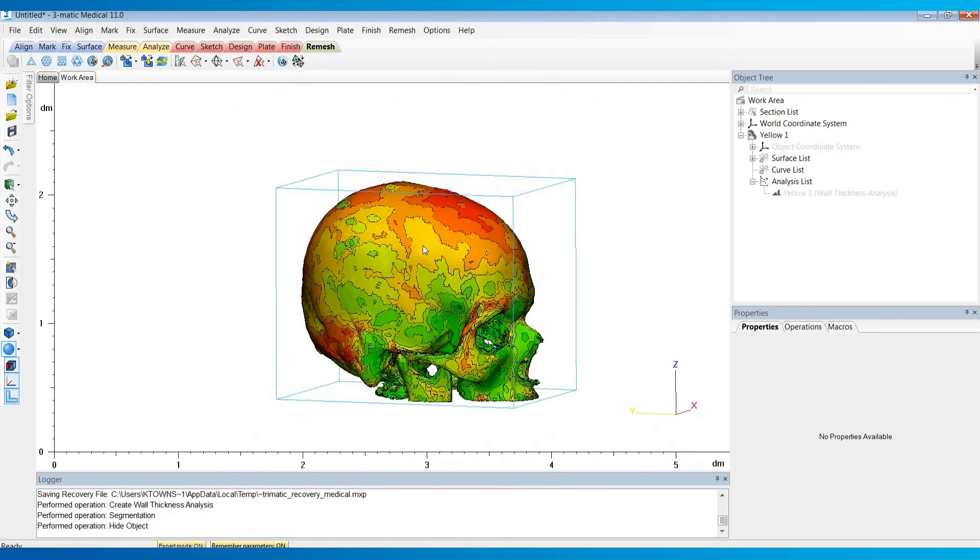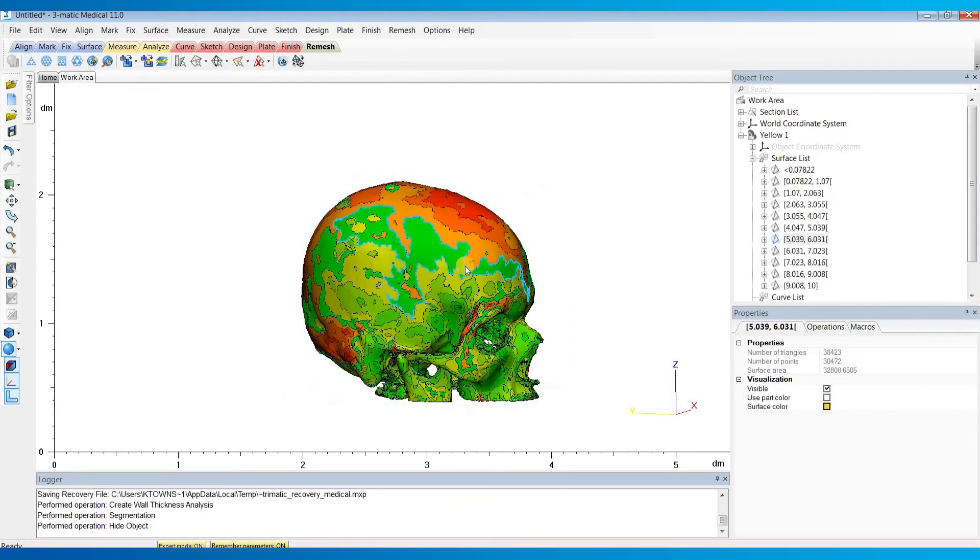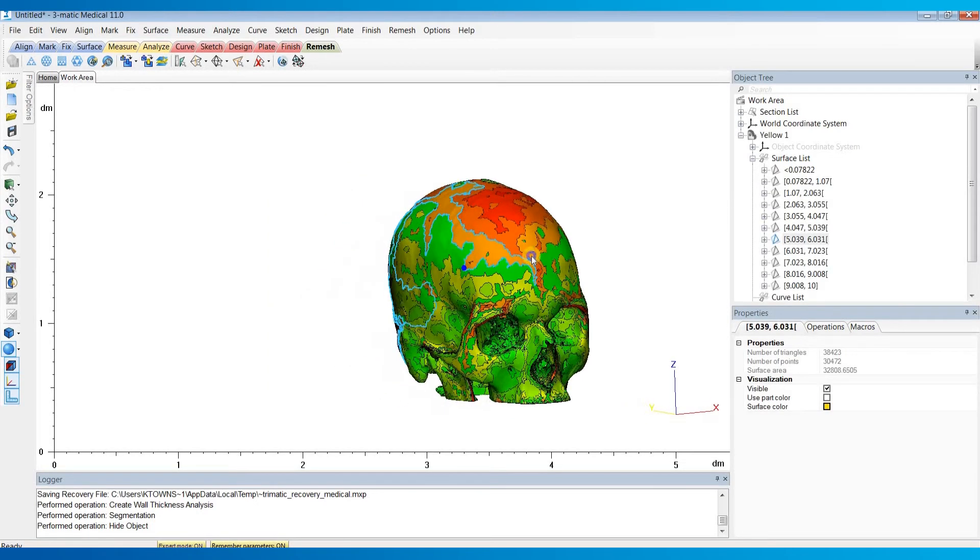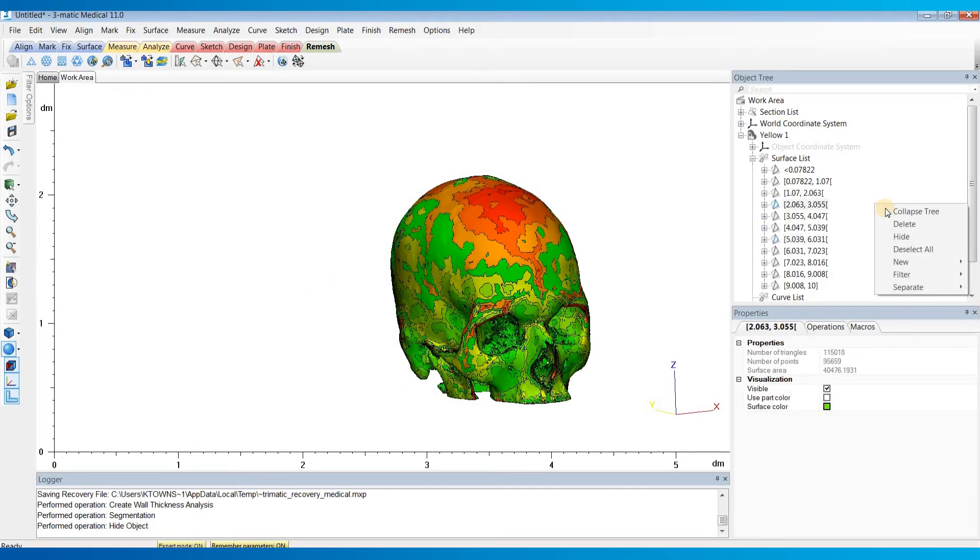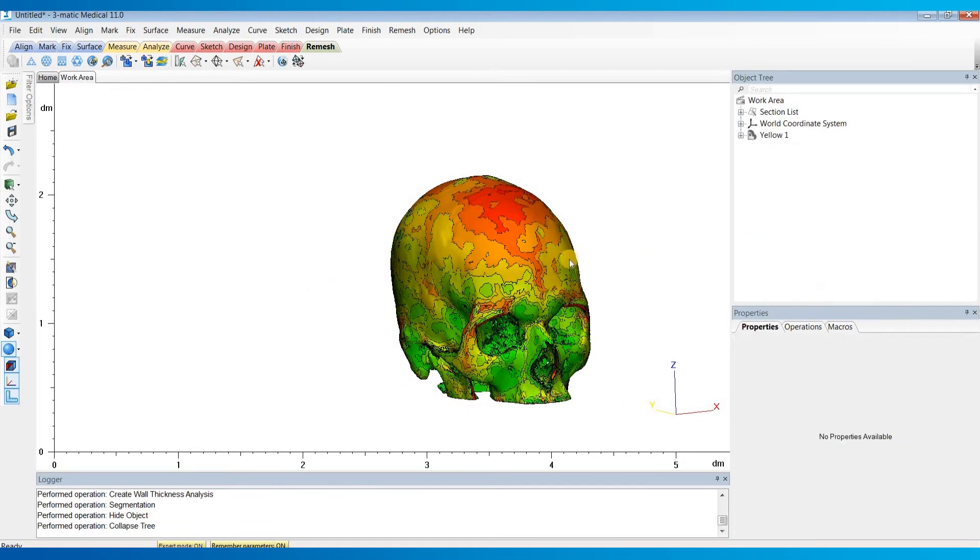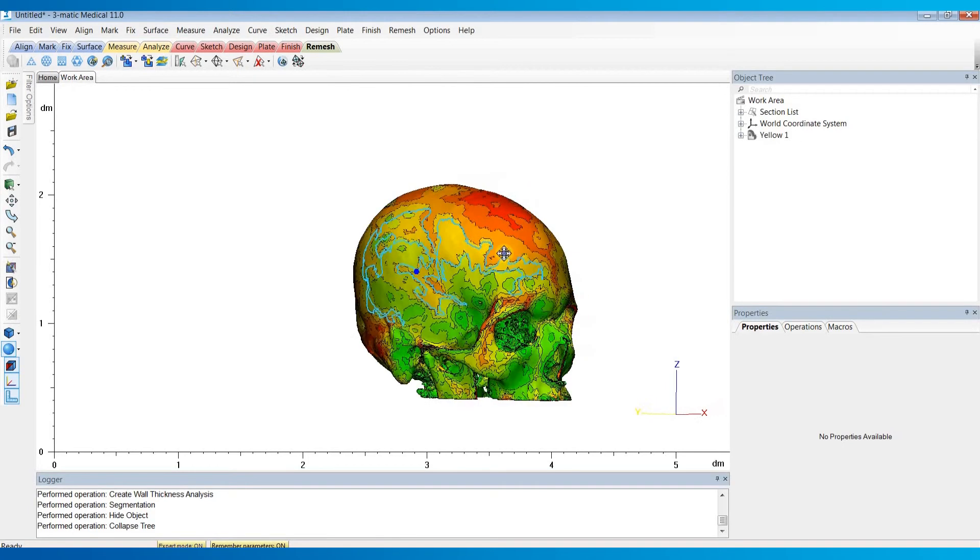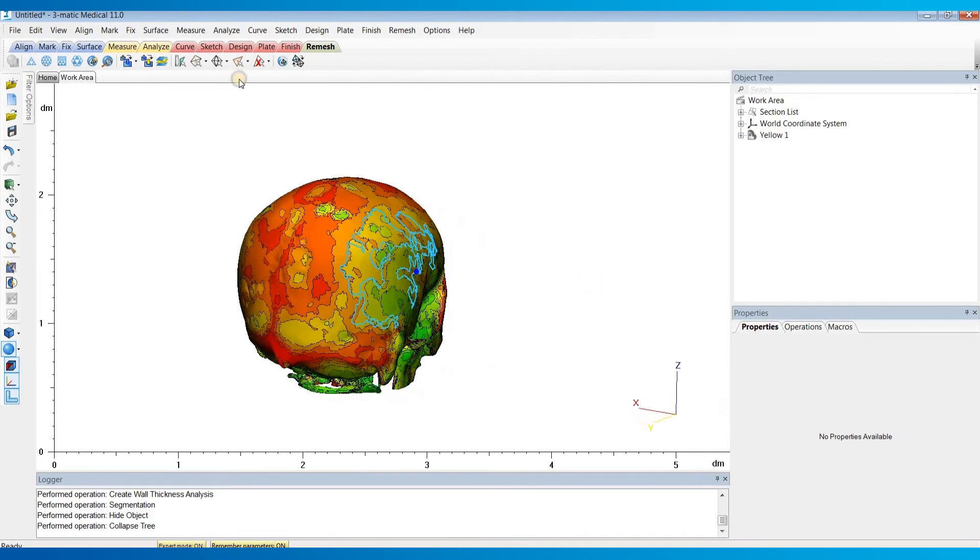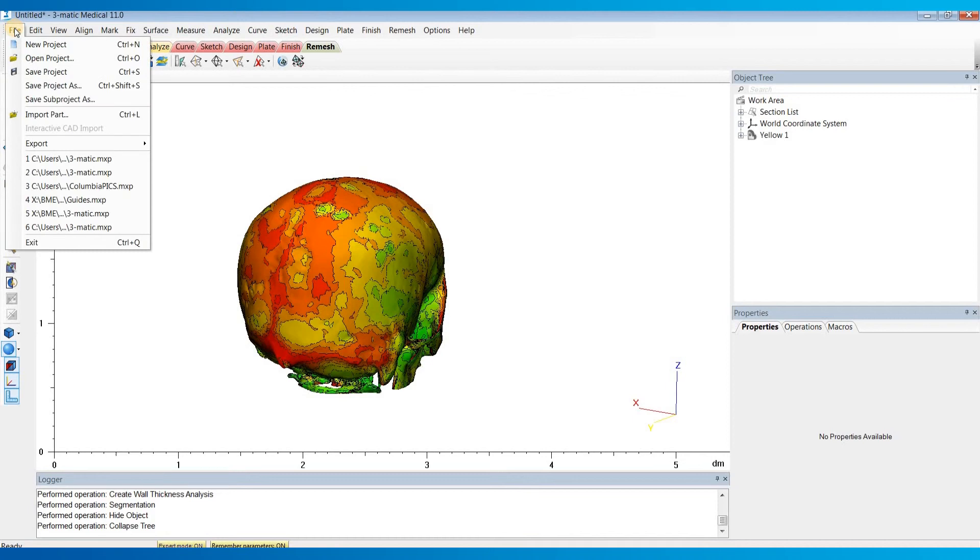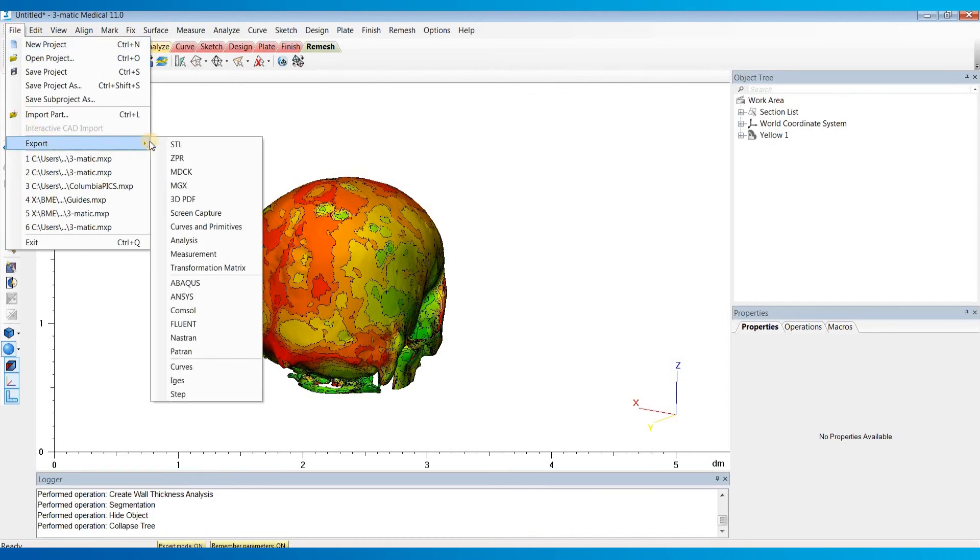And now if you have a printer that can print these kind of models, what you'll do lastly is go to File, Export, ZPR.